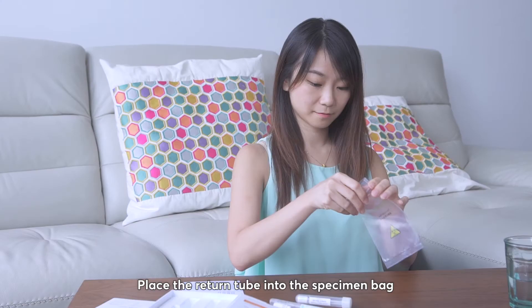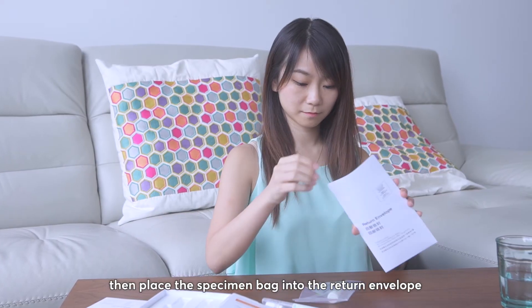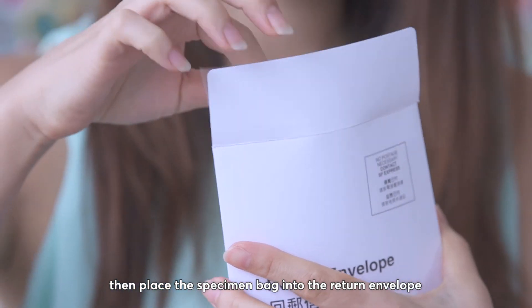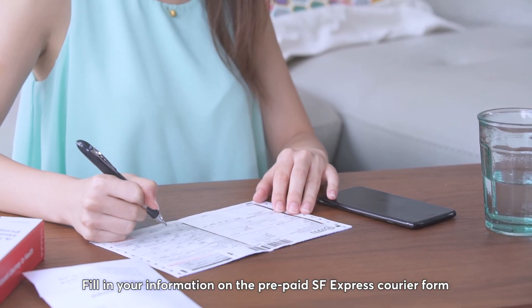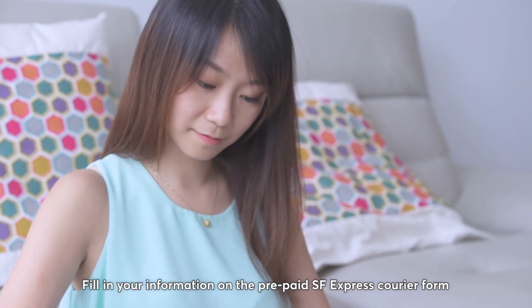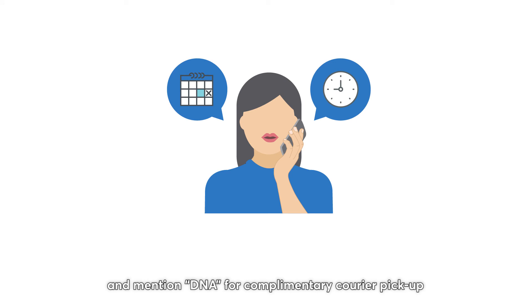Step 3: Return DNA Sample. Place the return tube into the specimen bag, then place the specimen bag into the return envelope. Do not expose the envelope to sunlight. Fill in your information on the prepaid SF Express courier form. Call SF Express at 2730-0273 and mention DNA for complimentary courier pickup.